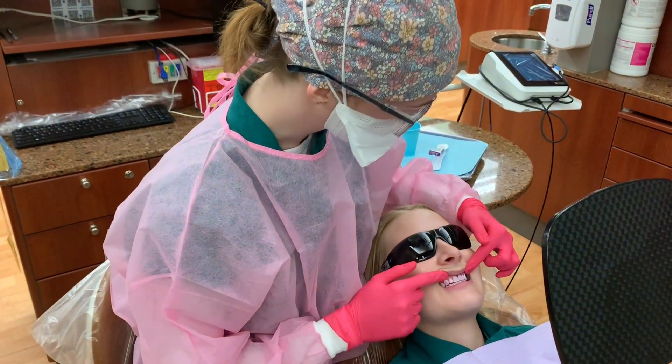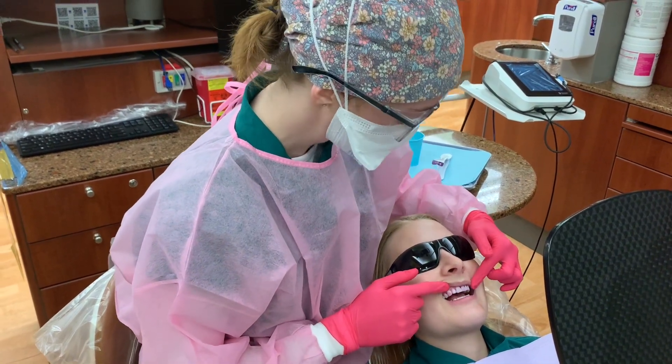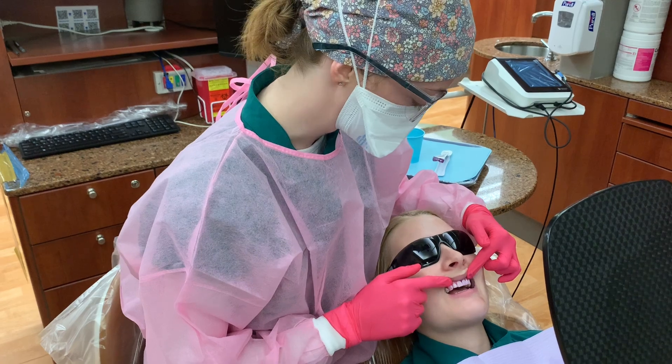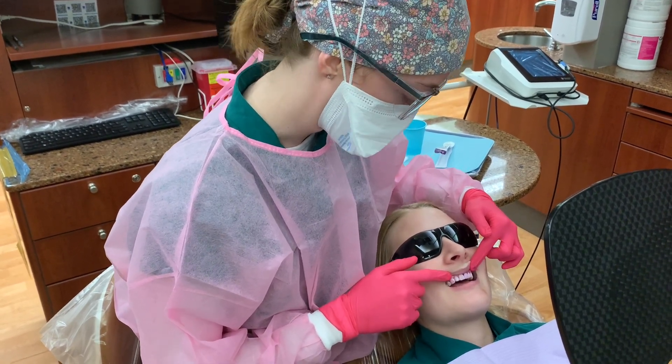The last color we're going to talk about is this light blue color that you can see. This represents acidic bacteria that sit on your teeth and can cause destruction and lead to cavities.